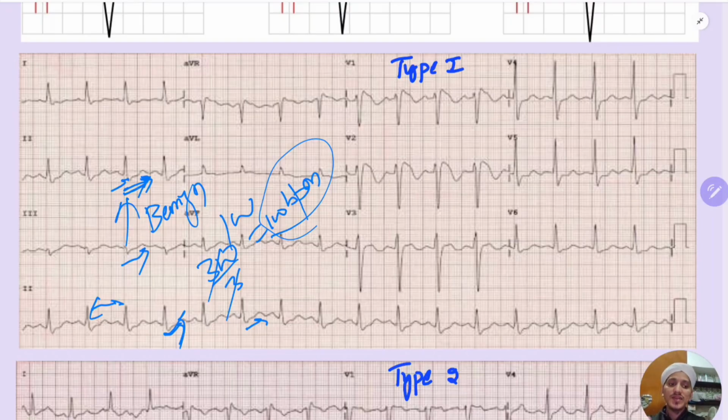Okay, upsloping is benign. Remember like this, upsloping is actually hard. So the hard thing is ischemia actually, and downsloping or horizontal is easy to run or walk, but upsloping is hard to run or walk. But in case of ischemia, it is opposite. Upsloping is hard actually, but it is benign in ST segment depression. Easy to walk is difficult in ST segment depression. That's one. Like this, you can remember these 3 types of ST segment depression. So easy walking is actually difficult, and difficult walking is actually easier, in ST segment depression.